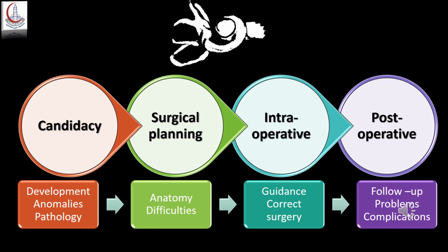Third, we can monitor our surgery intraoperatively, especially if there are any anomalies or problems. And finally, in the postoperative follow-up of the patient, to determine the proper placement of the electrode and in the event of any problems or complications.